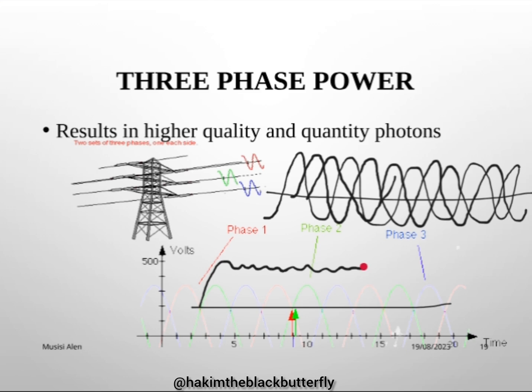If the X-ray machine, for example, is for 150 million Uganda shillings, and it has a three-phase generator, bringing that three-phase power supply to your facility can double the cost of that machine. It can cost you about 300 million.